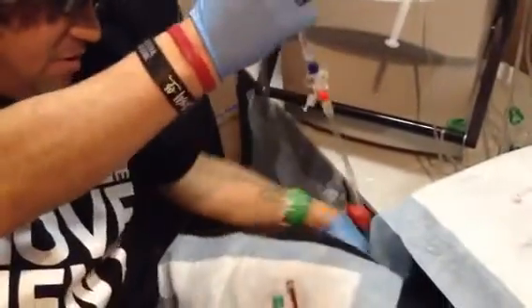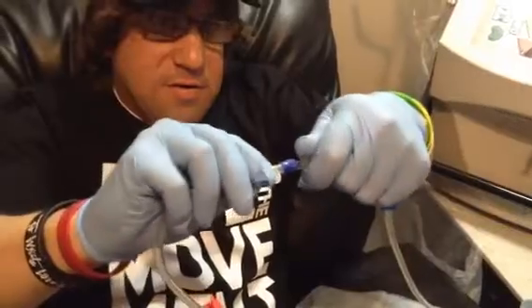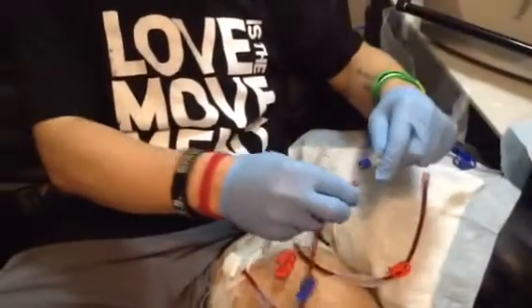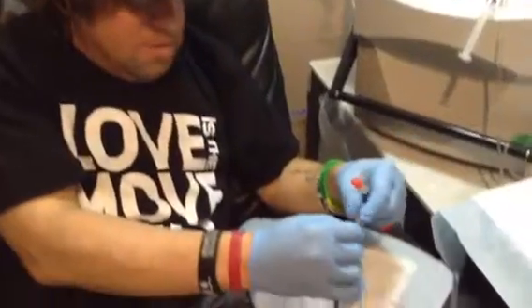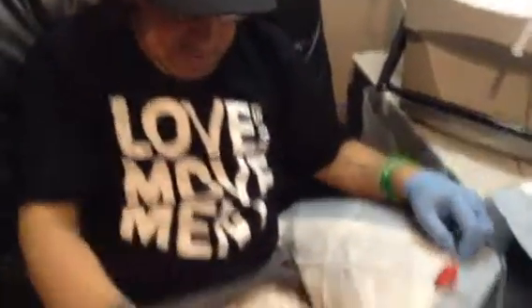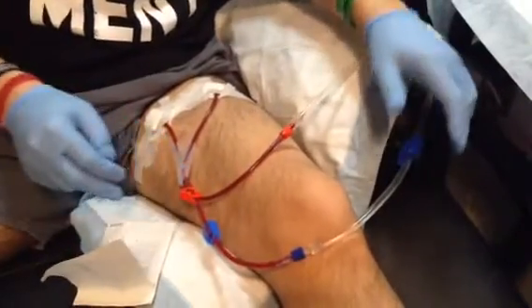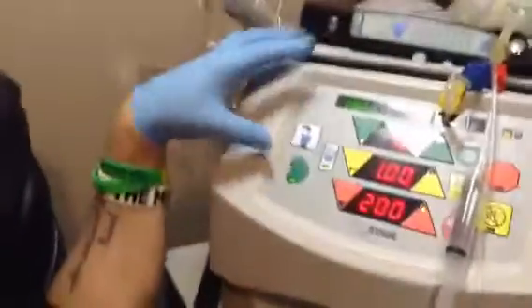Now I'm ready to hook up to the machine. I take the blue one and disconnect it, making sure you don't touch anything inside — you want to keep it clean. Then blue to blue, tighten that. Then take the red line and connect it. We are all hooked up. There are four clamps — you've got to make sure all four are undone or the machine will beep and alarm. Then you press this green button that looks like a kidney — that's the start button.